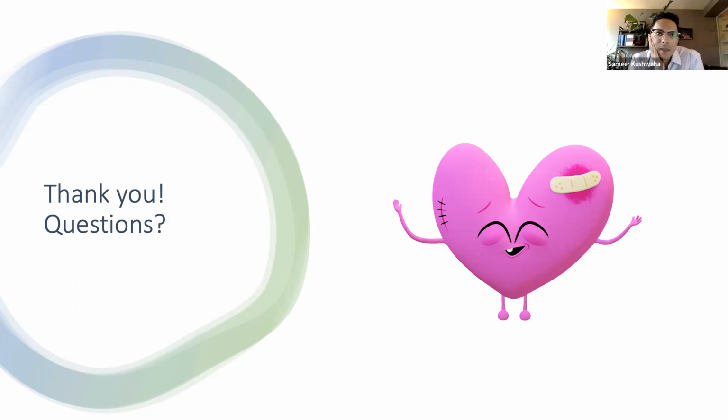I think that we're probably not going to be the people who are called down to the trauma bay the majority of the time. But because so many other specialists are interested in learning about it and are already using echo for a variety of applications, it becomes incumbent on us to do our best to educate people on what the common findings are that we're looking for and how to interpret them, how to tell artifact apart from real findings, and what is concerning and should prompt further assessment either by cardiology or by cardiac surgery.